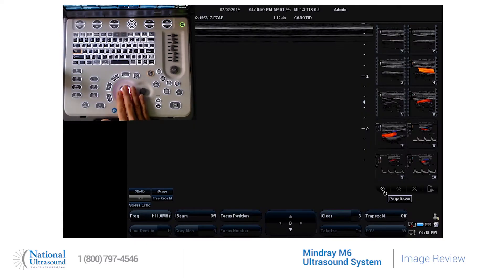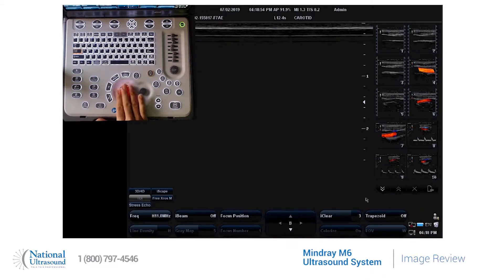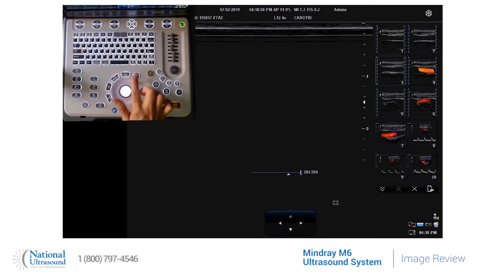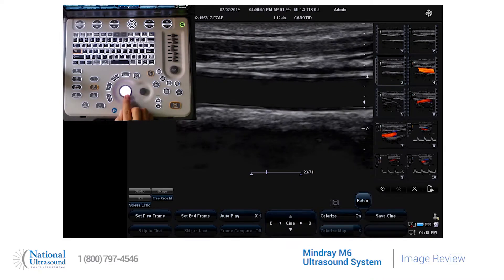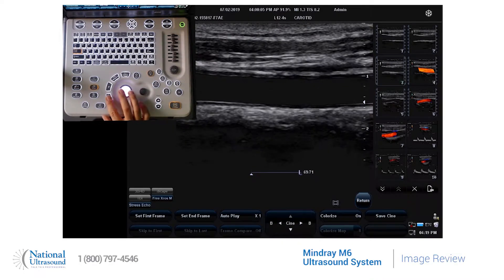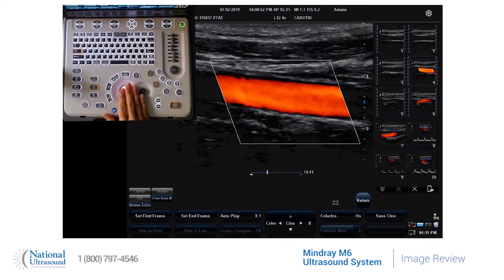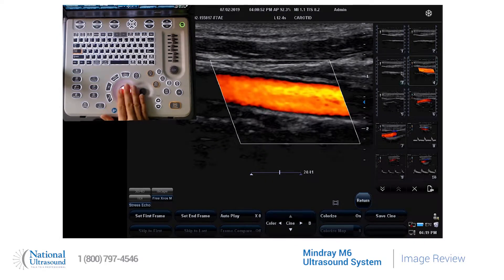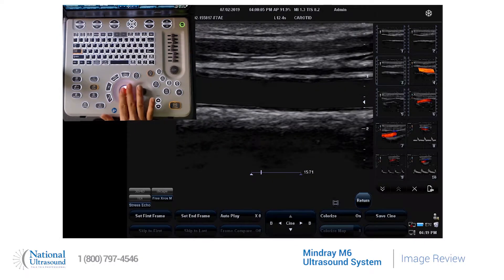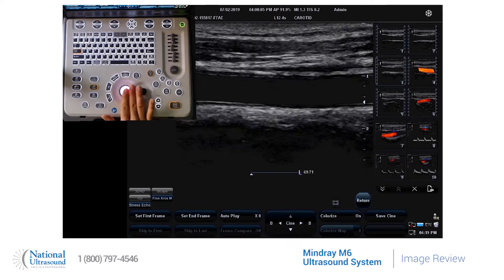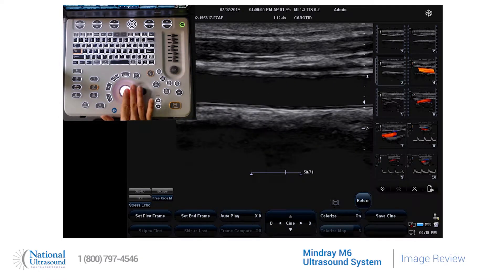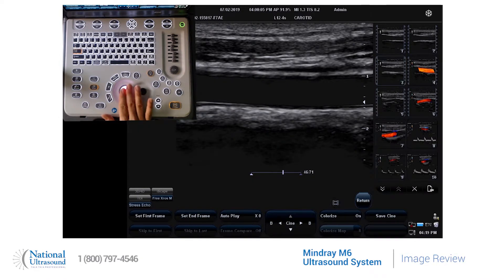If you would like to review images during your current study, press the cursor button. For a white arrow, scroll to any image that you like. If you double click on it, it will bring the image up on the screen. You can then use your trackball to scroll back through a cine loop if you have stored a movie clip.